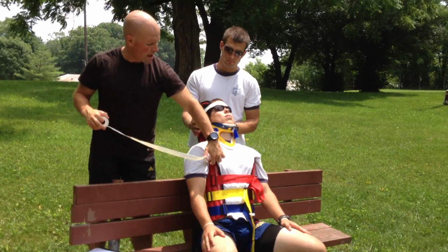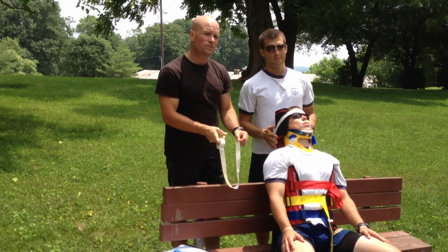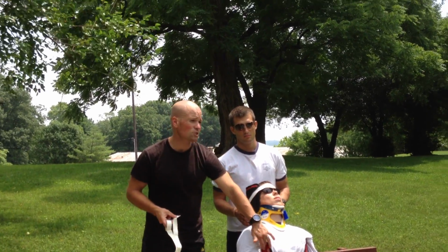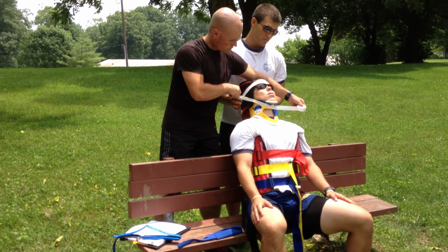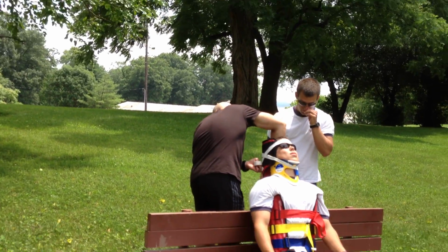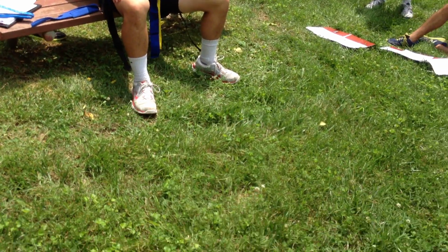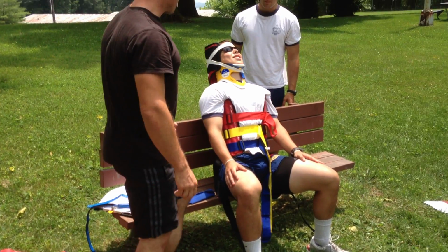Be aware, if you've done a bad job here and you haven't gotten all the space out of the armpits, when you lift this device, this piece is going to shift upwards on the head, and it'll feel like you're trying to hang your patient. So make sure that space is gone. Alright, now that I've got the head secured, indeed the stabilizer can let go. So, let's take a look and double check ourselves here.